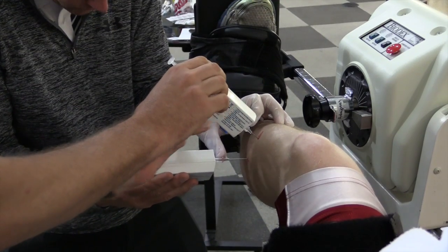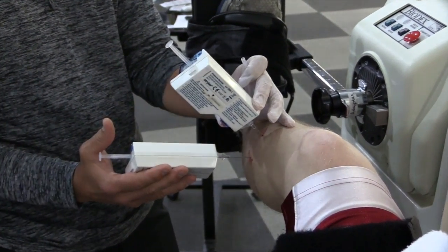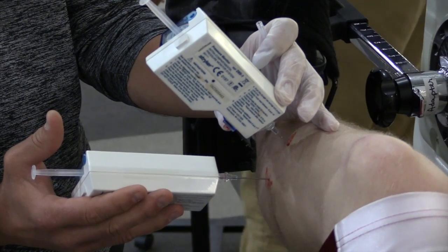These compartment measurements will be taken at an initial level, at one minute, and each subsequent minute up to five minutes.